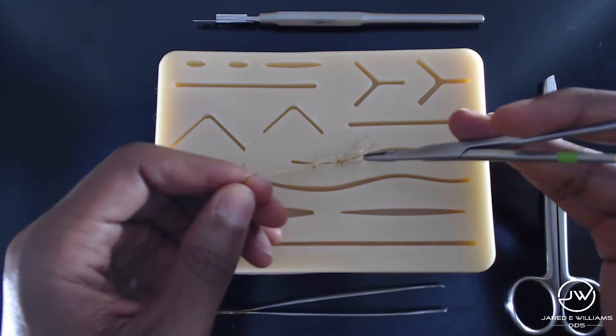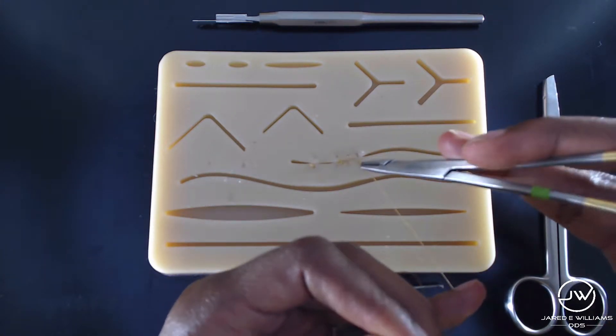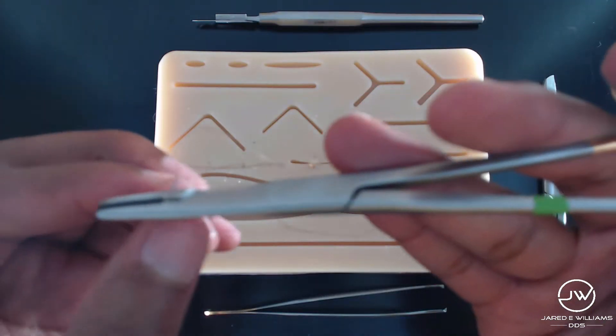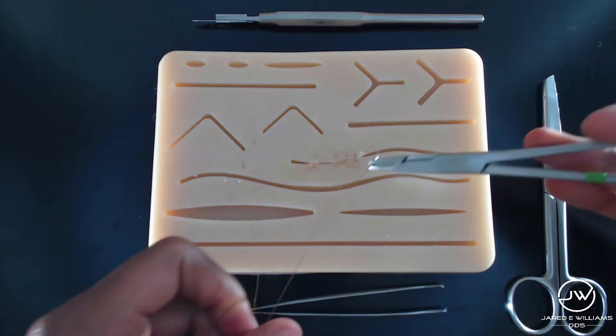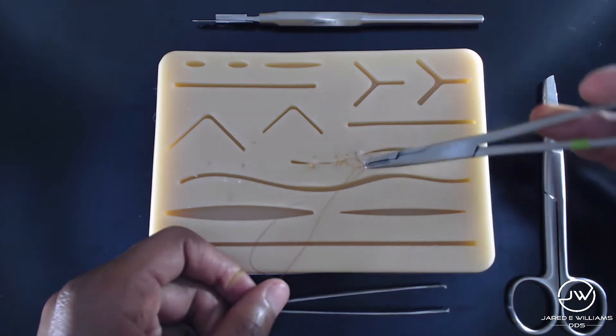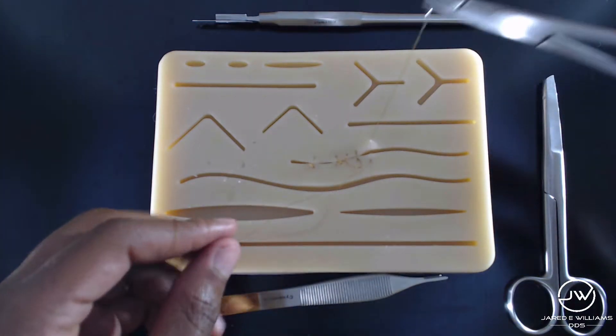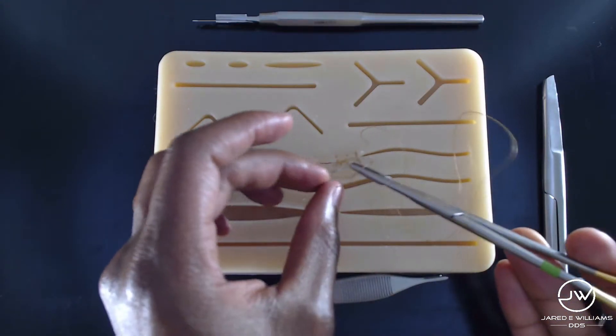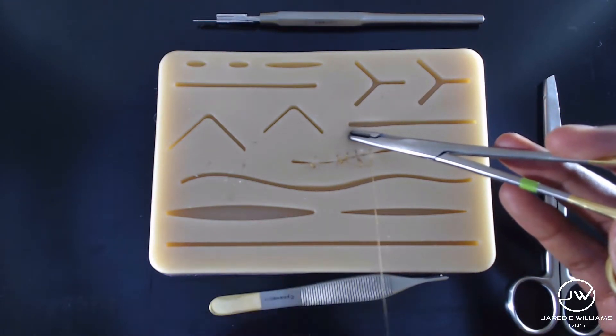And depending upon the type of tissue, I mean the suture that you have, knots are easily formed. On this suture board, it would probably be better for me to use a silk suture just because of the tissues. But chromic gut is my favorite and it doesn't act like this in the mouth. So, once again, I'm going to do another pass-through. Don't want to get too little of a bite.